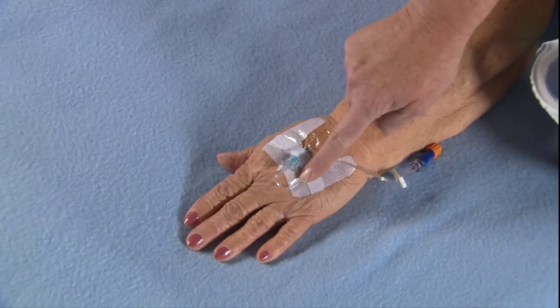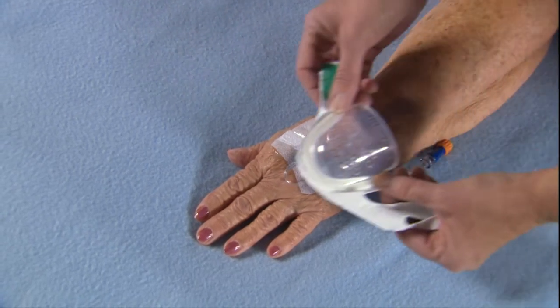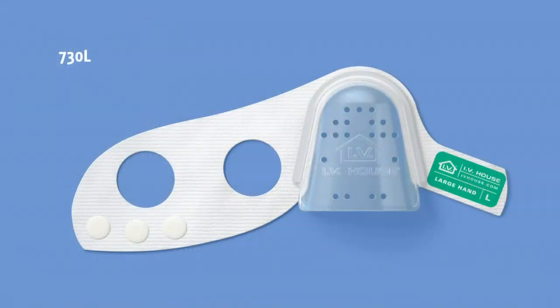Following IV insertion, tape the loop of tubing small enough so that it will fit inside the inner curve of the dome. The IV House Ultra-Dressing works for either hand, but it's the placement of the thumb that determines a left or right-hand fit.